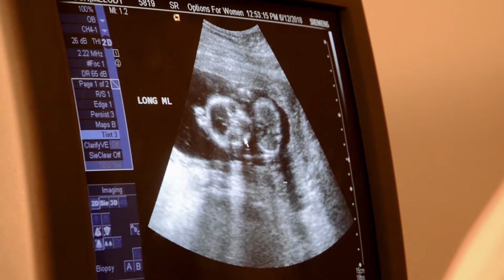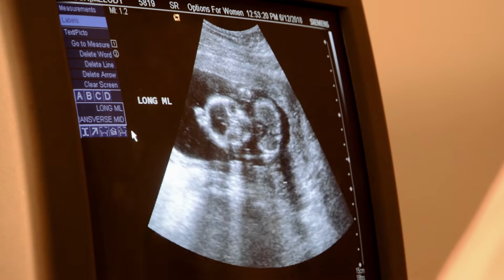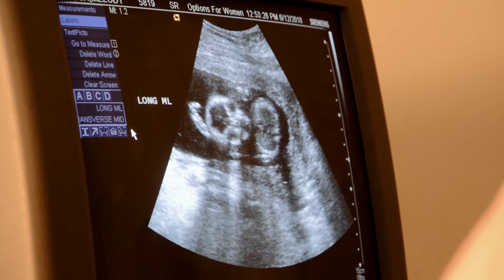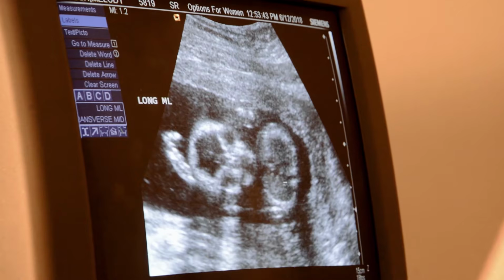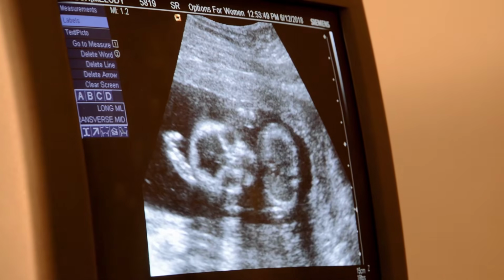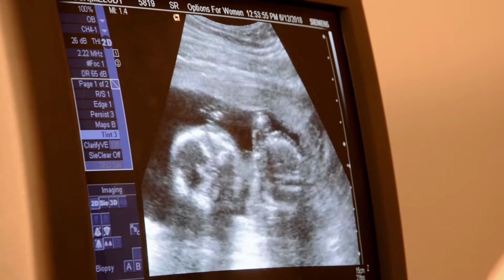Oh, I like that picture. I like that. He's got his mouth wide open. Let me send you back here. This is nice. When you see something you like, you can always send it back, capture what you like. Here's his mouth wide open, 2 eyes, and his hand over his head. And then if you want to zoom it, you can zoom it after you freeze, make it real big for mom. You can clear. And then, you like that one, Mom? Yeah. Okay, we're going to take that for you. Okay, and freeze.